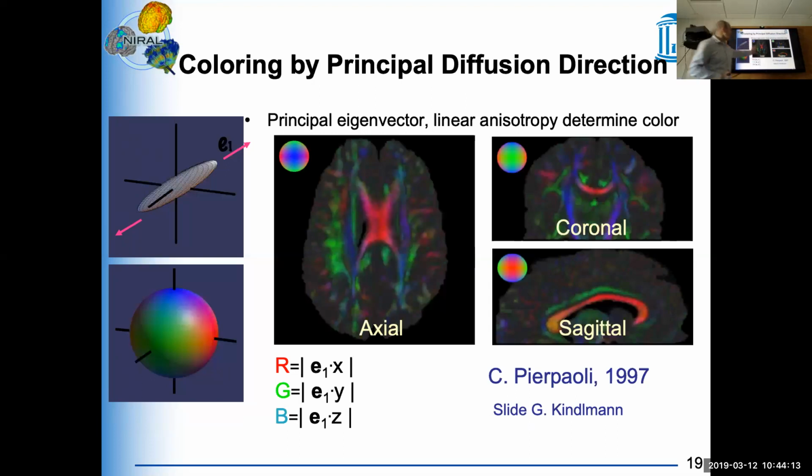And you can see these visualizations. It does not tell you necessarily whether there's a flip in orientations and so on. If left and right were incorrectly identified, basically flipped, the color would still be red, but the tensor obviously would be incorrectly oriented. So it has limitations, but looking at this still gives you a first impression of how your data looks.